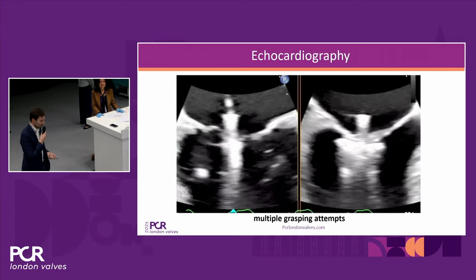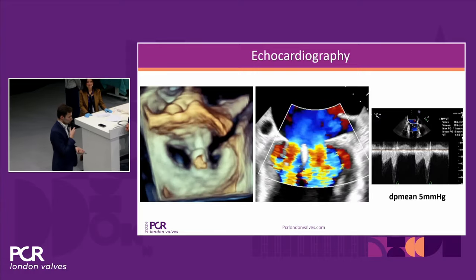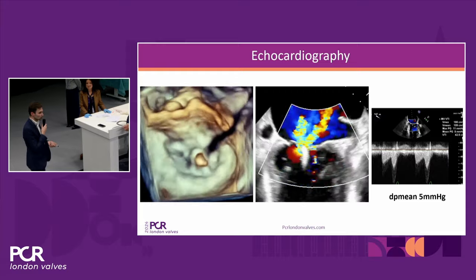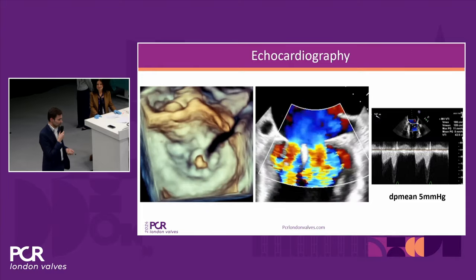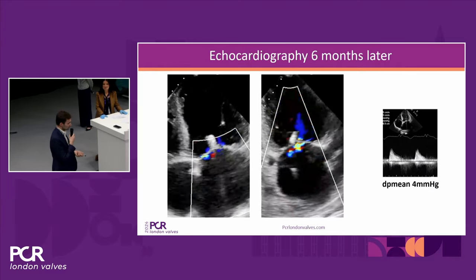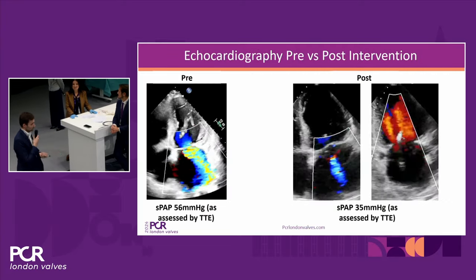And we were able to reduce the jet, but we had a gradient of about 5 at that point, so we did multiple attempts to improve it a bit more, but then we decided not to put in a second device, given that we reduced it massively compared to this massive jet as you have seen before. And actually the patient came back just a few weeks ago, and you can still see that there is some residual regurgitation. Gradient was now 4, and clinically the patient massively improved.